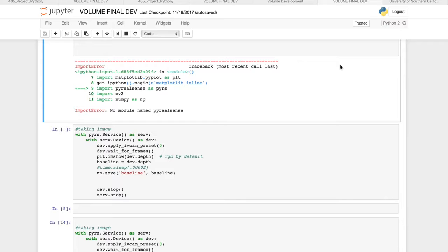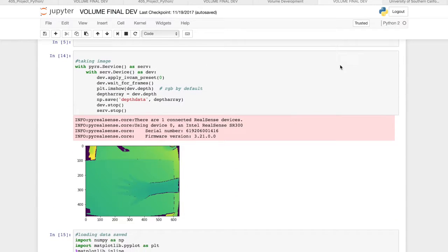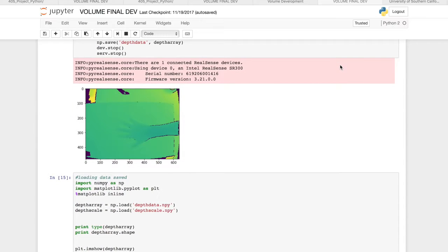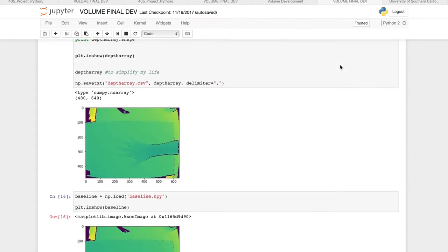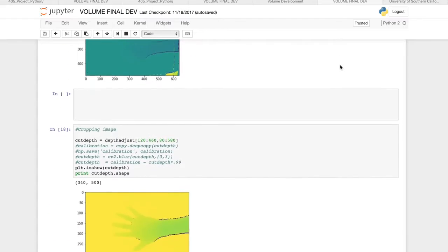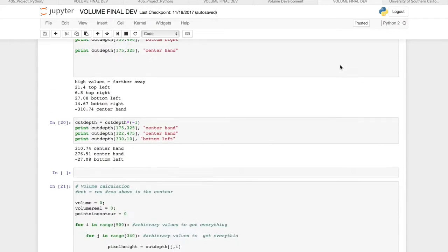One aspect of our project that we're particularly proud of is the fact that we both took a depth image from the camera, which is difficult to do in the first place, but then also create an algorithm to find the contours or the edges of your hand and then integrate within those contours. You can see in our code down here, we first have to take a photo of your hand, a baseline image, and then do a lot of segmentation and a lot of data calibration in order to get a usable image to take a volume with.